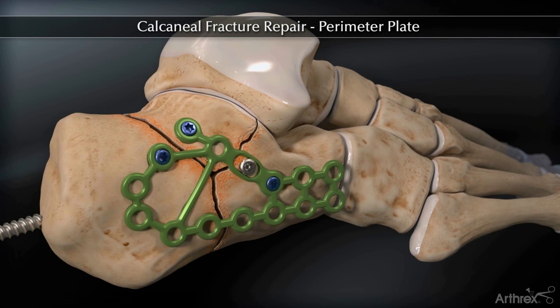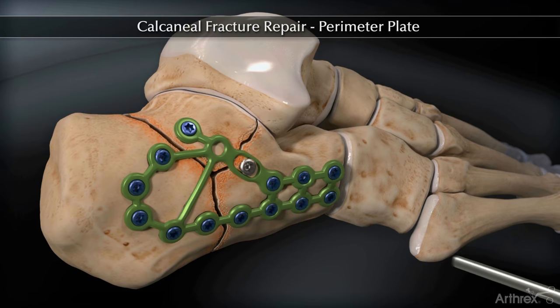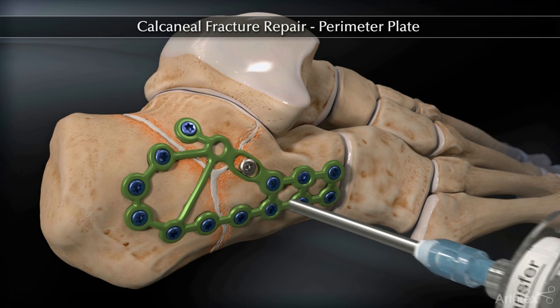Remove the Shantz pin and fill the appropriate holes. Insert quick-set to fill the remaining bone void. The fixation is complete.